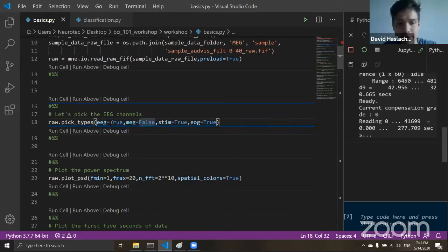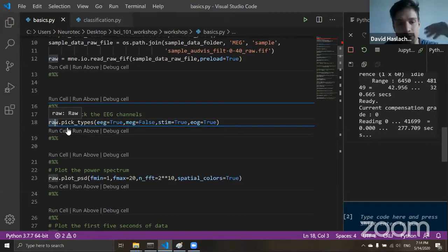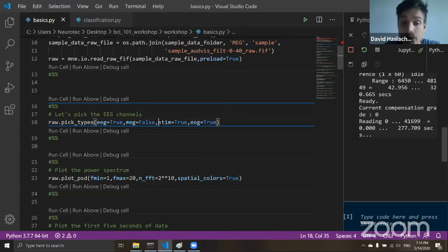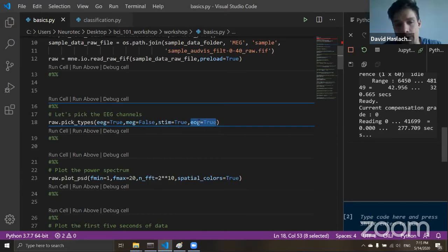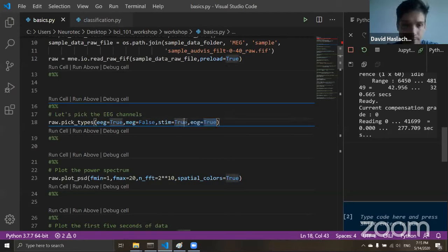The next step is to get rid of the MEG channels in the data. We have this raw class in MNE and it has a function called pick_types. We use this to pick the EEG channels — setting EEG equals true and MEG to false. We also keep the stim channels, which is where our trigger markers are saved, and we keep the EOG channels — electro-oculography — the two electrodes placed next to the eyes to measure eye movements. One main reason for keeping EOG is to automatically reject eye movement artifacts from the EEG, which are some of the biggest problems you'll have.